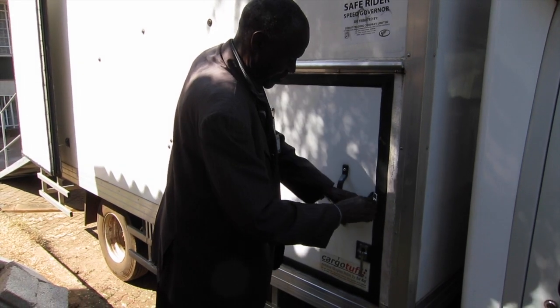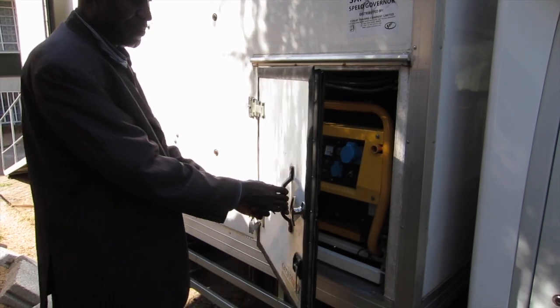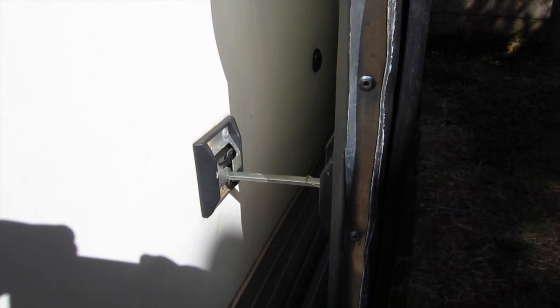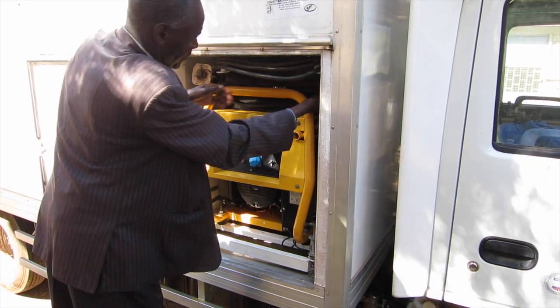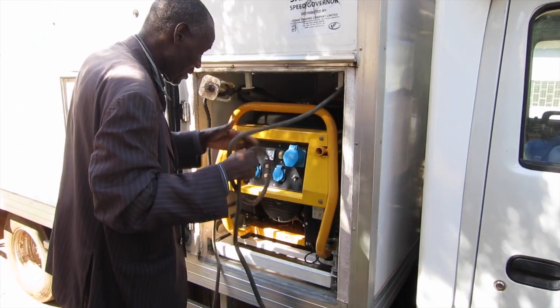Next, unlock the generator door and open sharply. Secure the generator door along the side of the truck. Remove the grounding strap and the grounding rod from its housing inside the generator compartment.